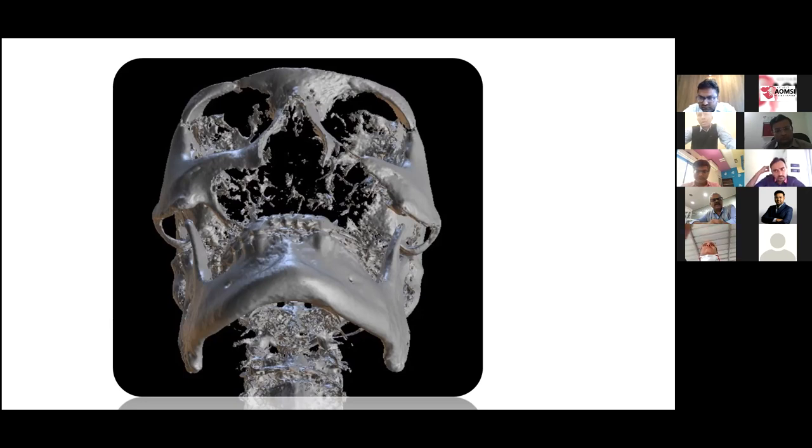I really appreciate what Neil has done as concerns the patient specific. My first choice when the zygomas have a good volume would be okay. So your first choice is PSI in this situation. Yeah. Dr. Kaushik, your thoughts? Yes, there is a good volume in the zygomatic bone, both the sides. It is well mineralized, I guess, now after surgery.